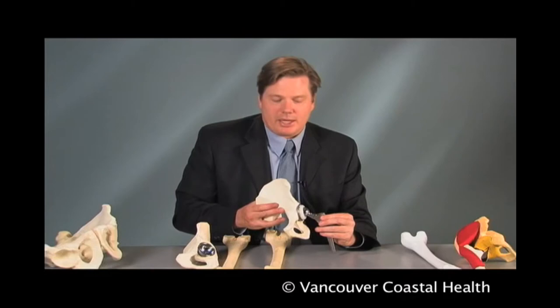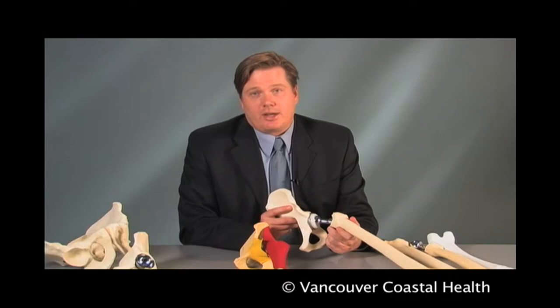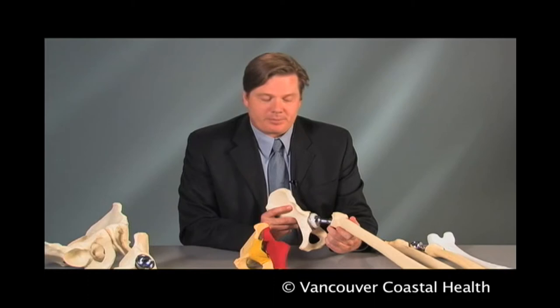A total hip replacement with a metal-on-polyethylene articulation is currently considered the gold standard around the world. The majority of first-time hip arthroplasty procedures will take 60 to 90 minutes of operating time to successfully complete.